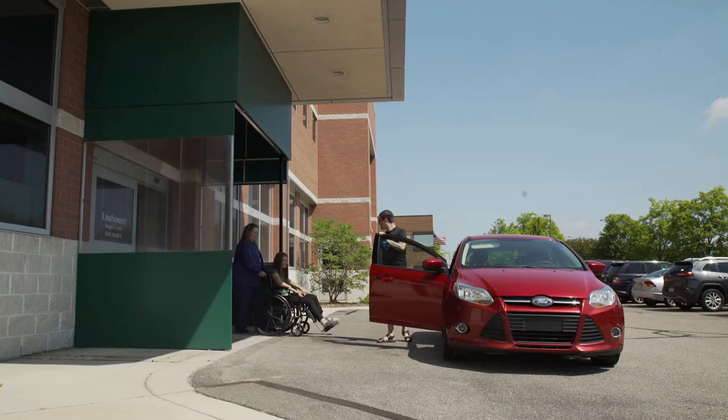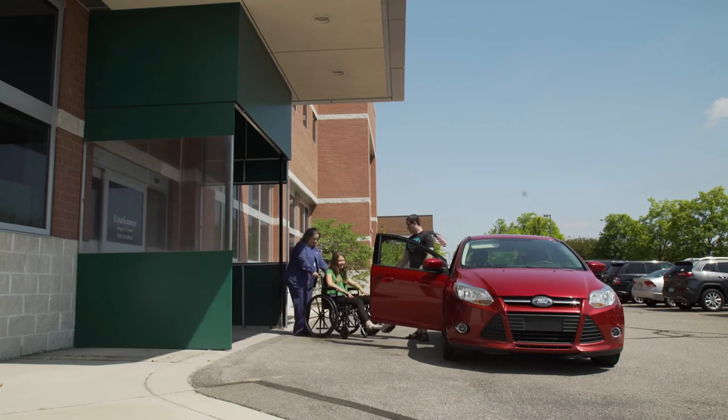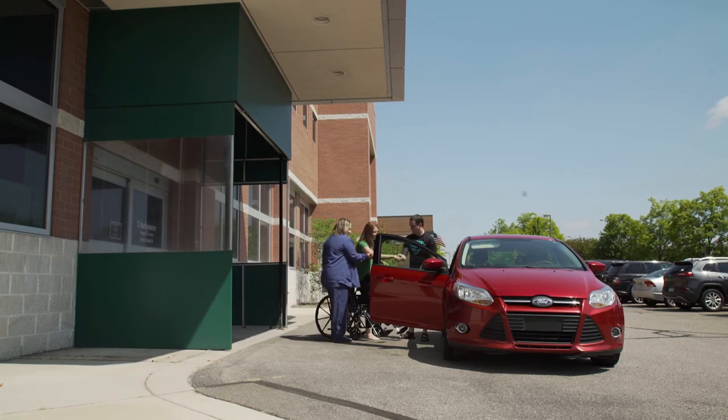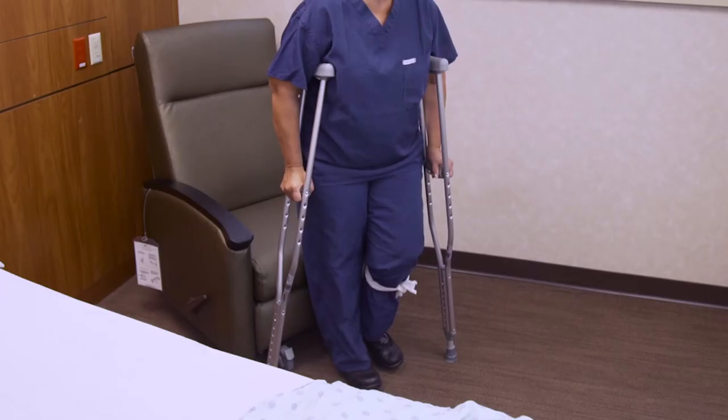Many patients will leave Unisource Surgery Center in a non-weight bearing status and eventually move up to partial weight bearing within just a few days. So it's important to know both ways of walking with your crutches.